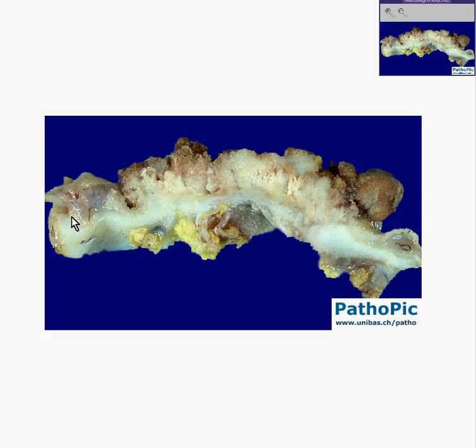I think when you get back out here again, you can see more of a uniformity of the wall. It looks like this may be submucosa. This may be a thin rim of uniform mucosa again. So my guess is that I'm going to exactly delineate the limits of the tumor right now.